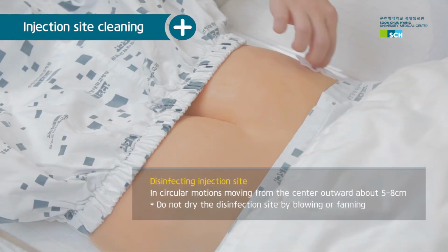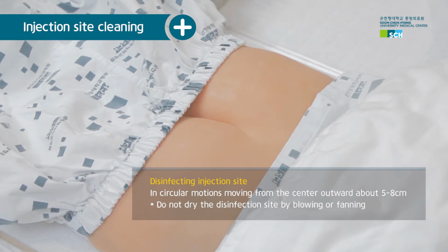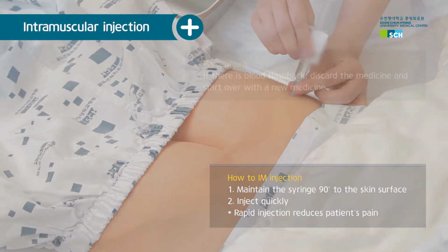Clean the injection site with alcohol swabs using circular motions moving from the center outward. Let the site be dry, then pick up the syringe with one hand to remove the needle cap. Stretch the skin tight with one hand and inject at 90 degrees to the skin surface.